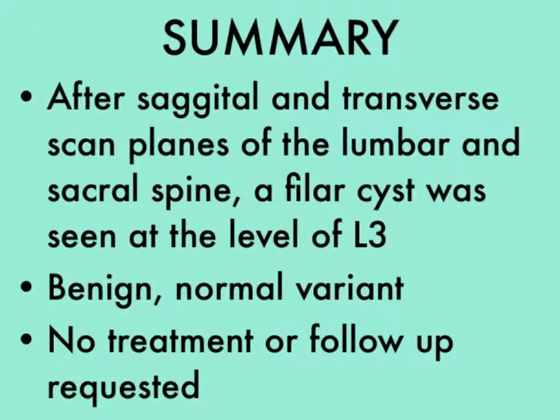In summary, again, a filar cyst was found in both sagittal and transverse scan planes of the lumbar spine, specifically located at the 3rd lumbar vertebrae. This is known to be a benign and sometimes even normal variant of the spine, so no treatment or follow-up was recommended.